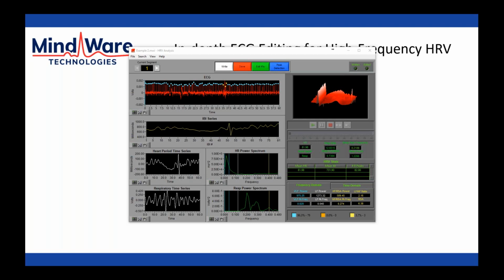So what I would recommend if you're looking at a 10-minute period, unless you're wanting to examine low frequency or very low frequency components of the waveform, is this. Low frequency is some unknown mixture of sympathetic and parasympathetic influence, and it's more commonly used in clinical applications than when we're trying to quantify RSA or look at something psychological. If you're looking at low frequency components, then maybe you have to look at 10-minute segments.